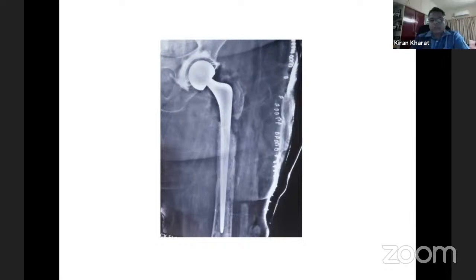And so what is the length of the stem? Much stronger. So all options. Okay, it's like a modular stem. You get the options, diameter, everything. So it is an independent cementing of the stem, and then you build the body like you do in an uncemented revision. It's available in India now. We have asked them to quote in our tender, so they're likely to get it.